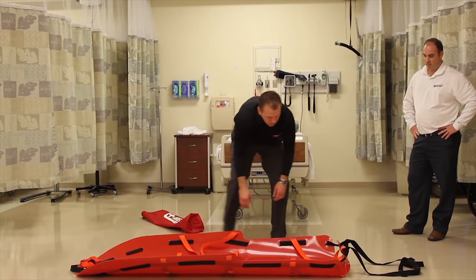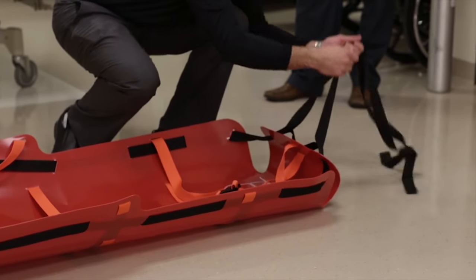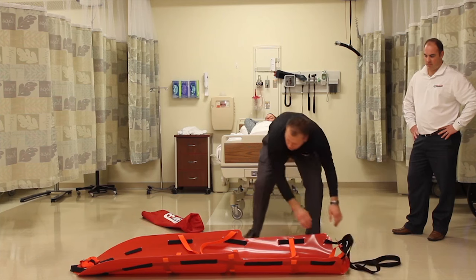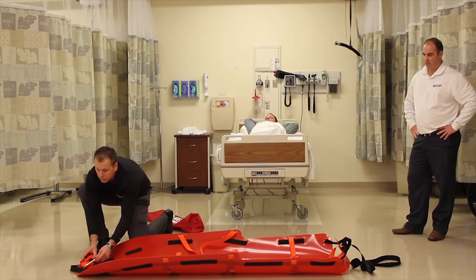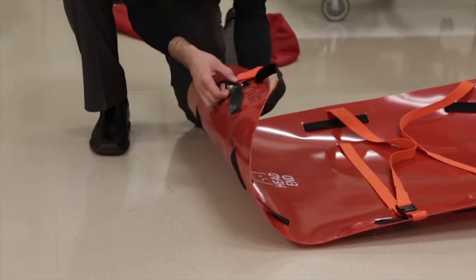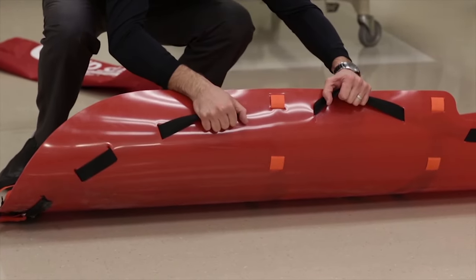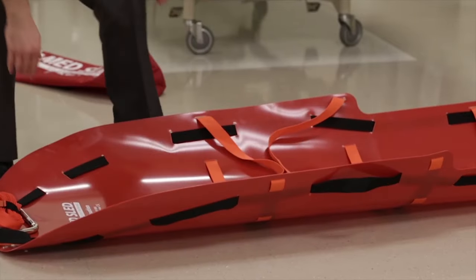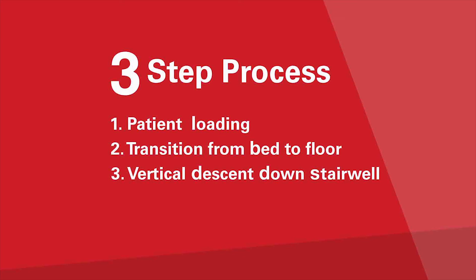As a reminder, there are three cross straps and a foot loop strap at the foot of the sled. The foot end also includes two black pull straps. At the head end is the vertical descent braking system which connects to the perimeter tether. The perimeter tether runs along the side of the sled and can be used as handles for sliding and lifting the sled. The next phase of the evacuation is a three-step process: patient loading, transporting the patient from bed to floor, and vertically descending down the stairs to the extraction point.